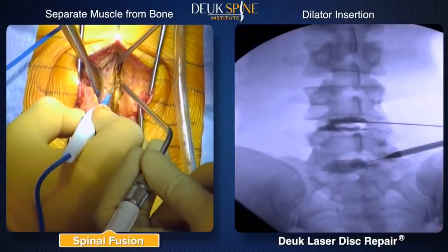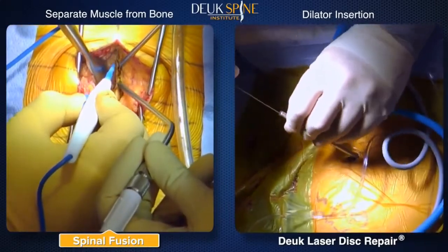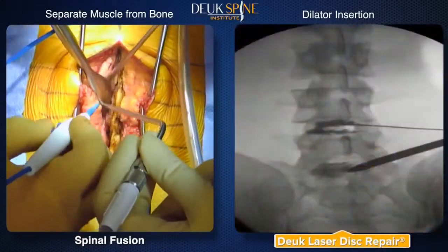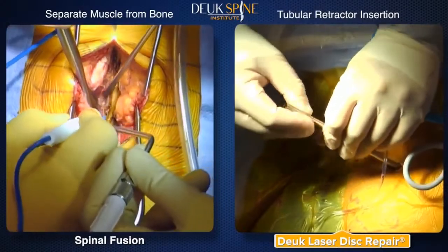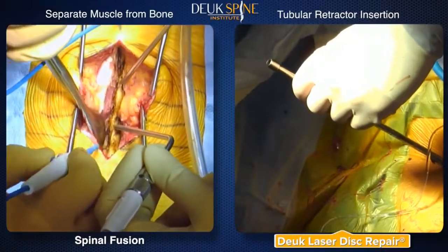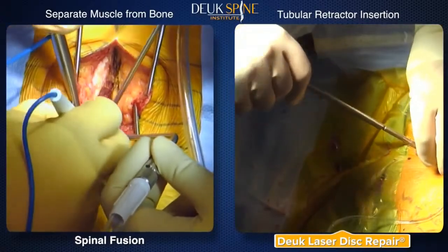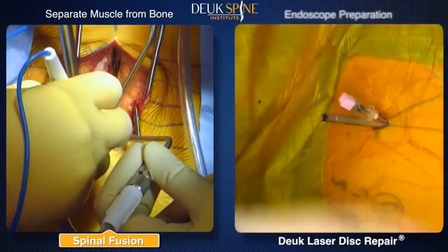The incision for the fusion continues, including penetrating the skin, fat tissue, and multiple layers of muscle through to the bone. With the Deuk laser disc repair, a mallet is used to advance the tip of the dilator into the symptomatic disc. A tube, called the tubular retractor, slides over the dilator and is carefully positioned into the disc, again using the mallet. The rest of the entire Deuk laser disc repair surgery will occur inside this narrow tube. To access the spine, the spinal fusion requires the muscle to be separated from the vertebrae.